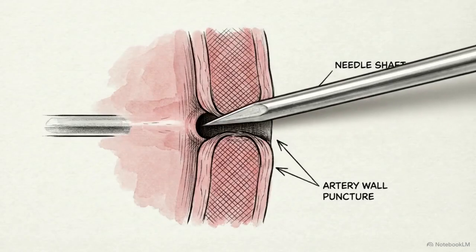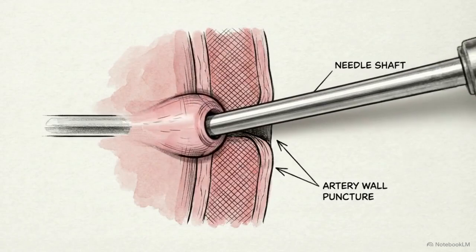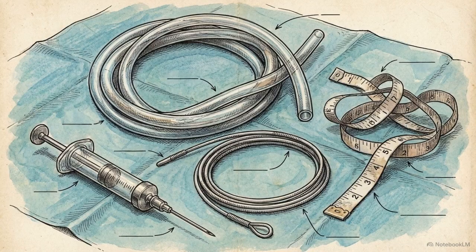Endovascular interventions demand micro-precision. A fraction of a millimeter at the access site is often the deciding factor between success and a severe vascular complication. Achieving that precision requires navigating a disjointed toolkit. Unlike pharmacology or standard surgical instruments, endovascular tools do not share a unified measurement system.